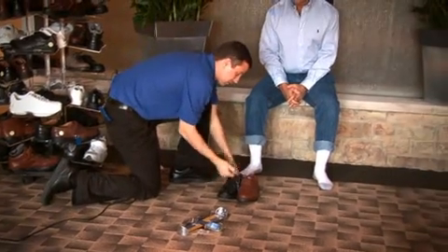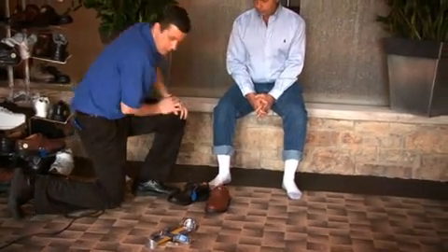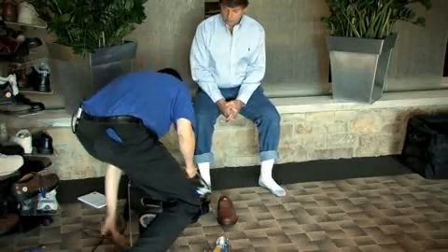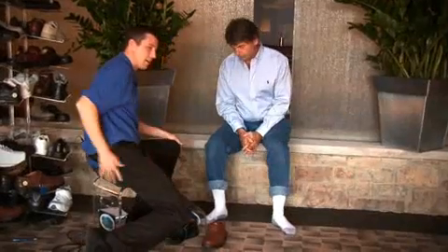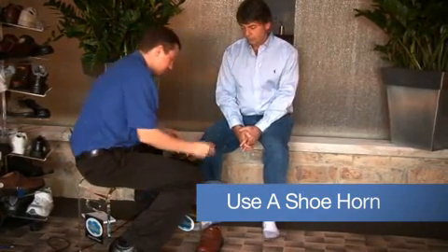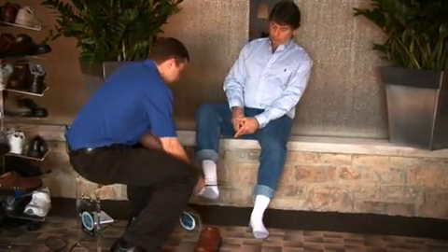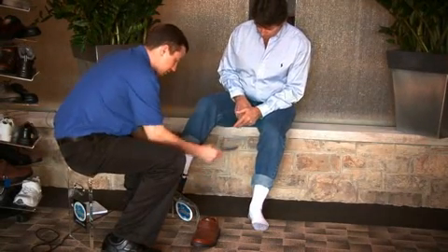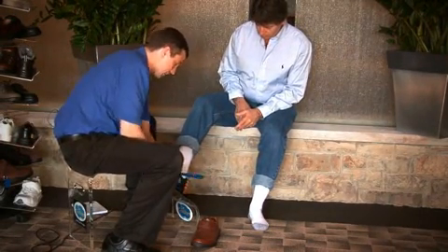So looking at this, we will take that 10 wide and use a helpful fitting stool, just so I don't have to stay on my knees the entire time. From right here, grab a shoe spoon or a shoe horn, and this is where we're going to attempt to fit the patient. Ask him to lift his foot up using that shoe horn. I also call this the counter saver, just so we're not pushing down in the back there. So we put that on and fasten it securely.